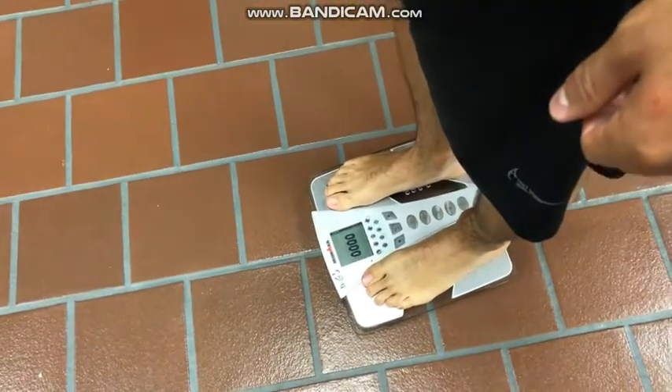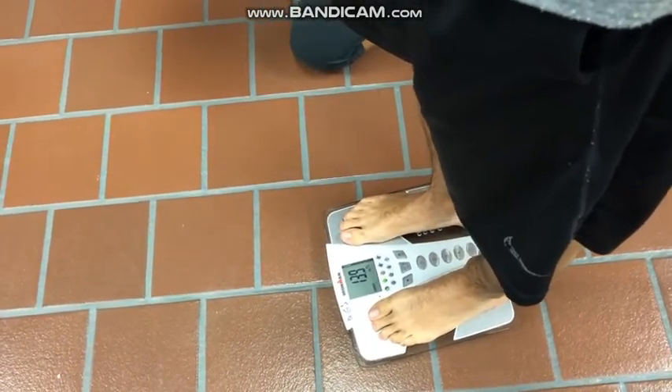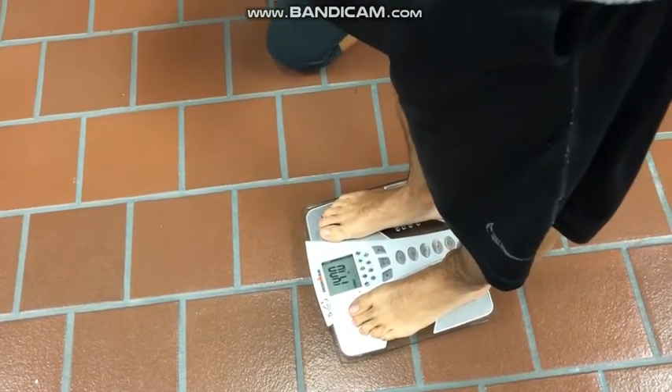The scale will provide values such as body fat percentage, water percentage, muscle weight, physique rating, and basal metabolic rate. Once the measurement is complete, the participant can step off of the scale. So let's take a look at the scale.